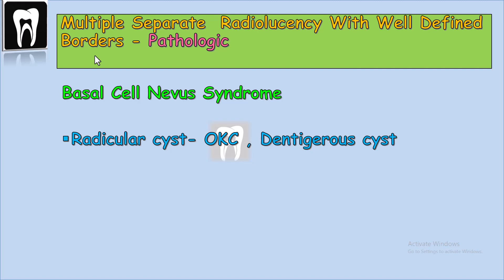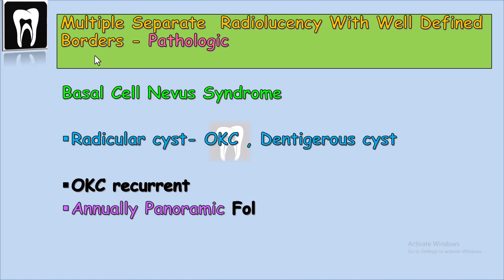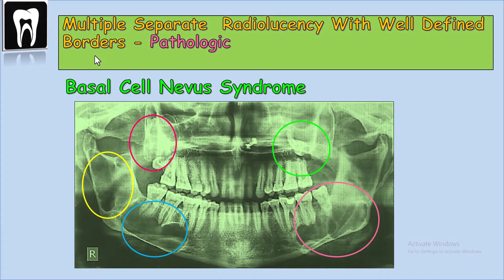Basal cell nevus syndrome is mostly diagnosed in childhood. If the cysts are OKC, they are more likely to be recurrent. So after surgery and removal of the multiple OKCs, the patient needs to be followed annually with panoramic x-rays. In this panoramic, we can see multiple cysts in both jaws. The cysts can be multilocular or unilocular.